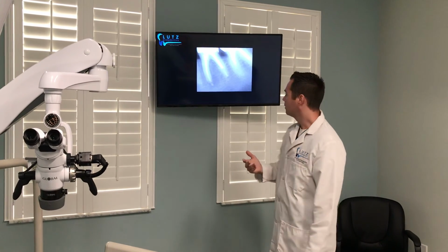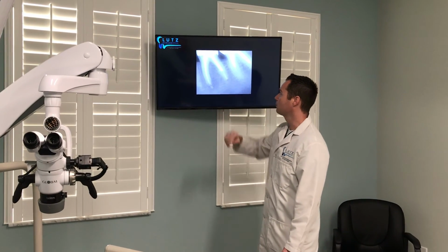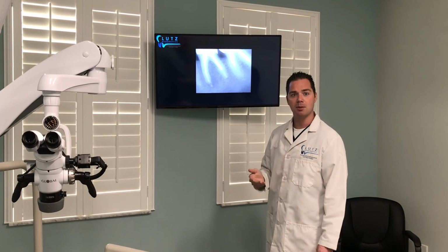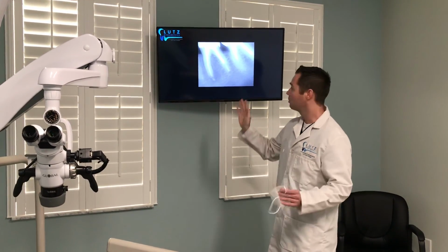And this is just our final, where we sealed it with the bioceramic sealer, placed permaflow at the orifice, temporary restoration, and sent it back to the dentist for them to go ahead and do a permanent restorative material. Really looking forward to seeing this case in 6 months to a year with complete bone fill.